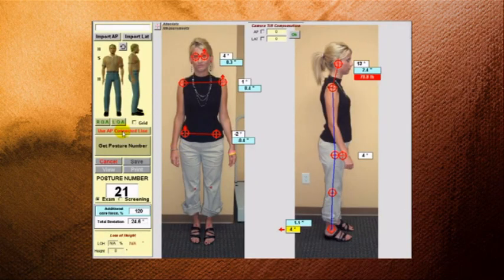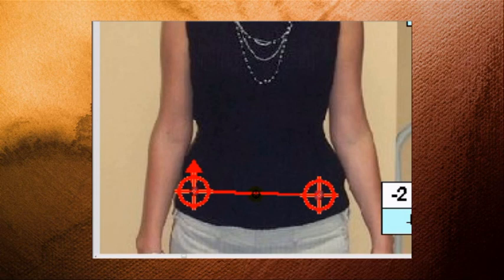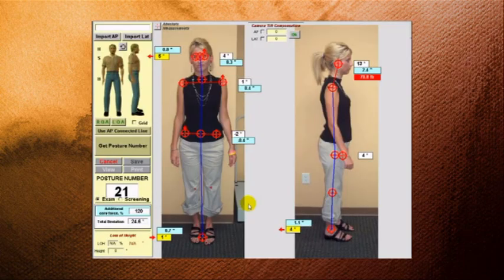We've also enhanced the A to P connected line, so again it automatically zooms in and jumps to the next point, which it does not do in previous versions.